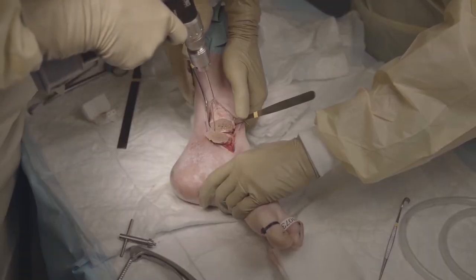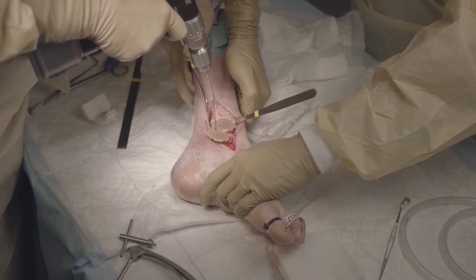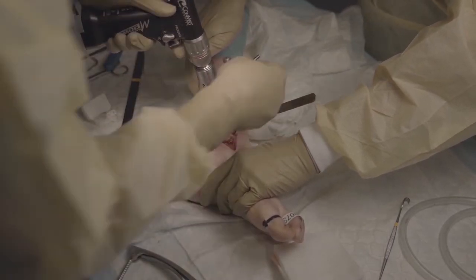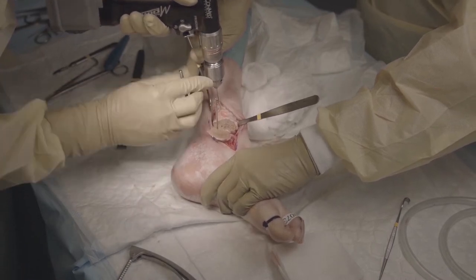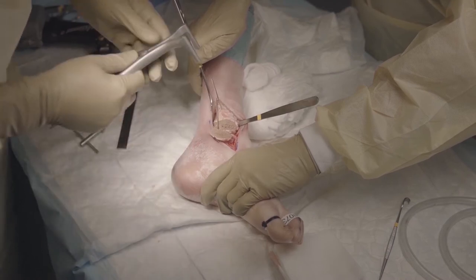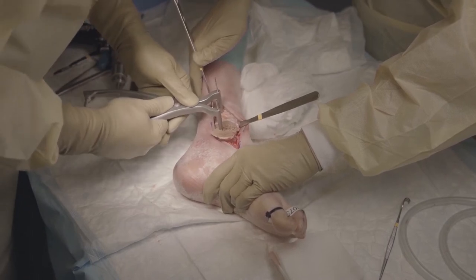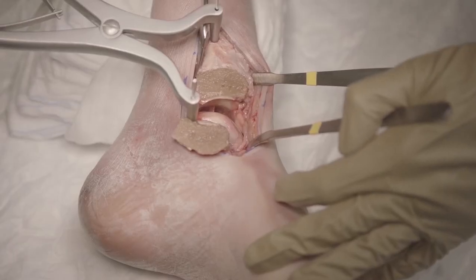Then we will place 2 K-wires, placed away from the operating field in order not to interfere later on with the drilling. We place them for the Hintermann distractor, and you will see when we open the Hintermann distractor that we have good access to the talus. It helps to do a release of the posterior capsule in order to have more opening of the joint.